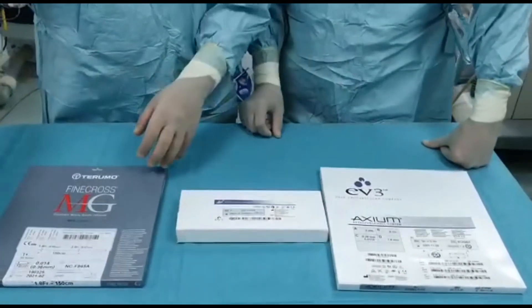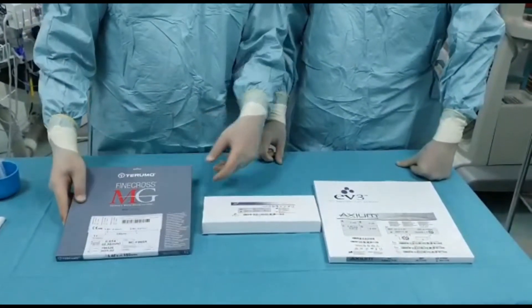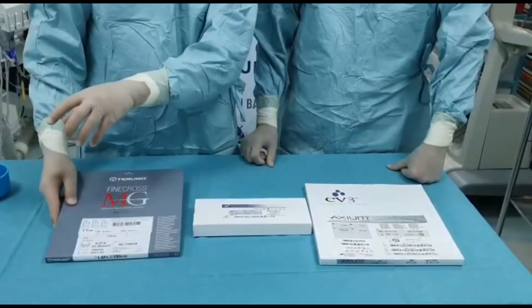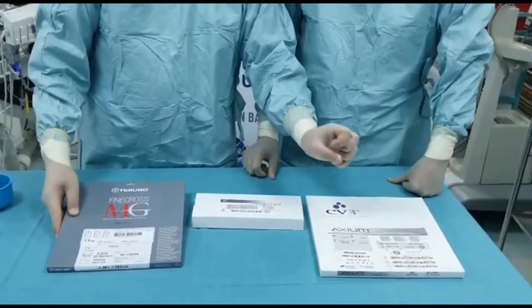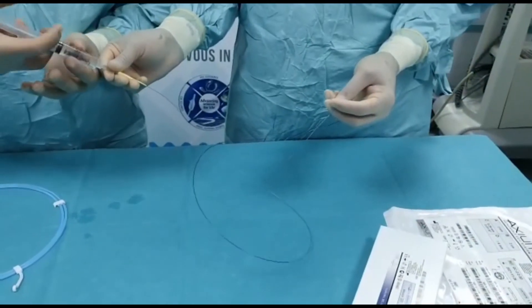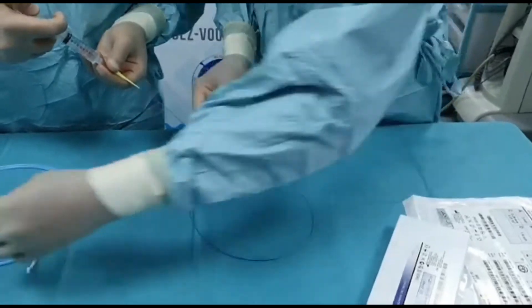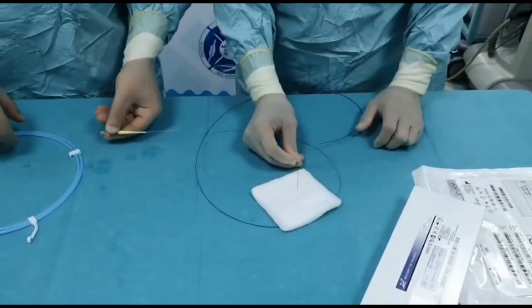So you have a perforation and a micro catheter in situ. The purpose is to deliver this coil into the distal perforated vessel, and the detacher will be used to detach the coil when you're happy with the position. We flush the micro catheter — it's flushed.